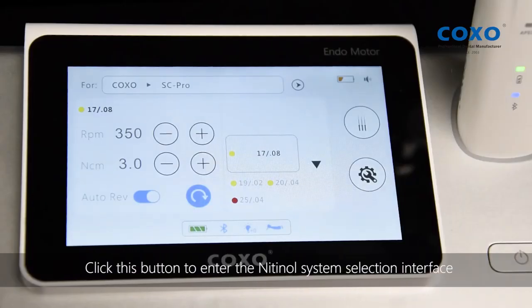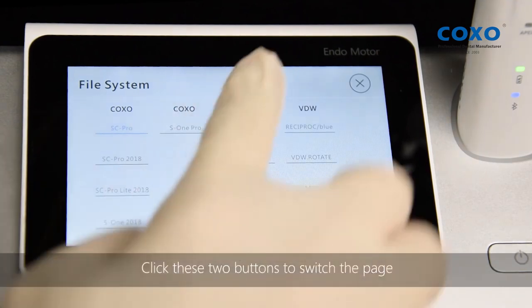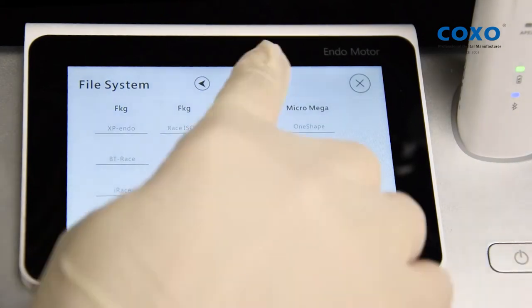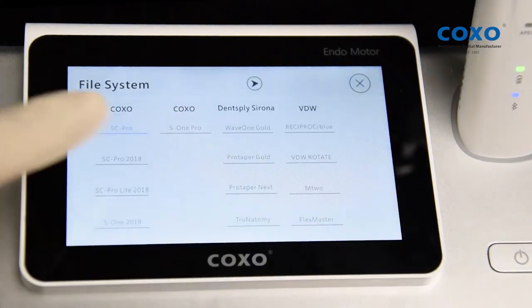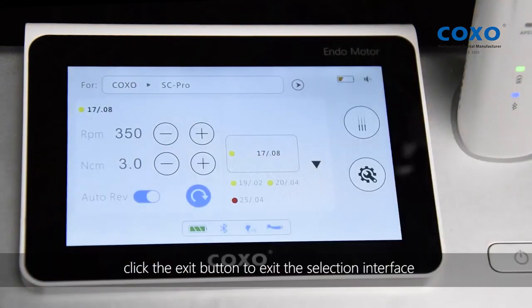Click this button to enter the Nitinol system selection interface. Click these two buttons to switch the page, select the manufacturer and Nitinol system as needed. After the selection is completed, click the exit button to exit the selection interface.